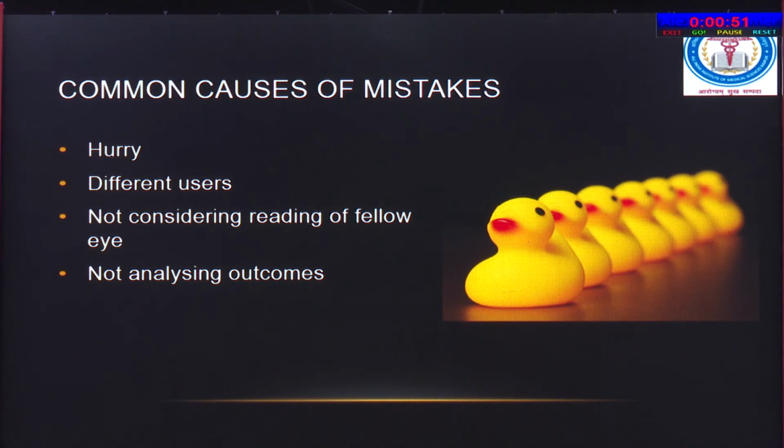Not considering the readings of the fellow eye, for example, different axial length, different K values, is another important point which has to be kept in mind by residents while performing the A scan biometry. And of course, it is for us that we are not analyzing the outcomes.